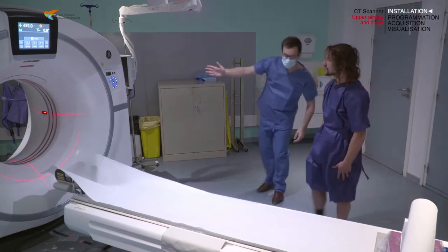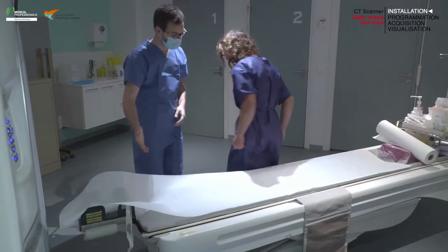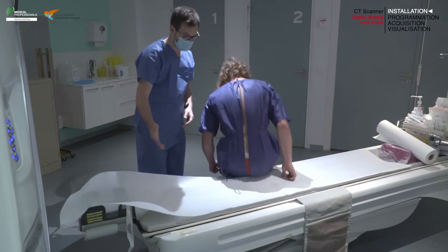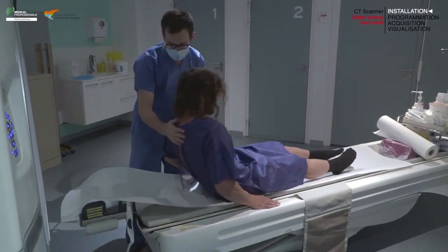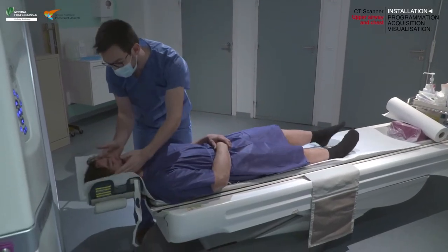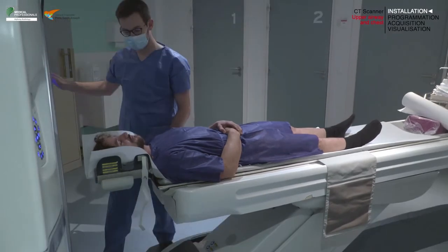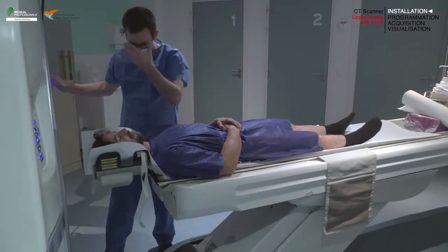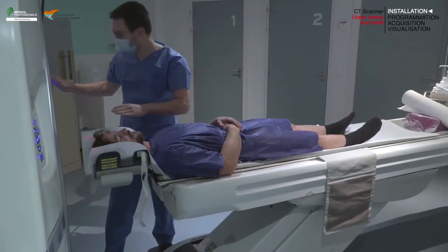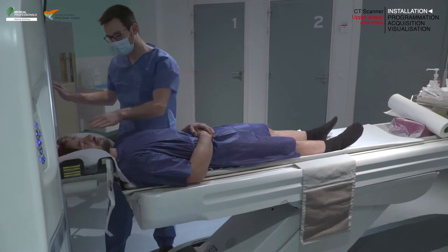Once you have verified the patient's identity using two identifiers, such as first name, last name, and date of birth, place your patient on the CT table in a supine position with their head settled in the head holder.